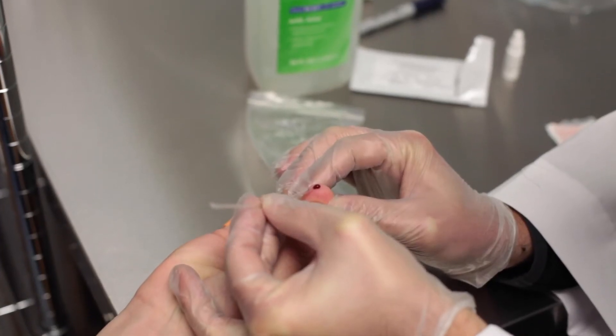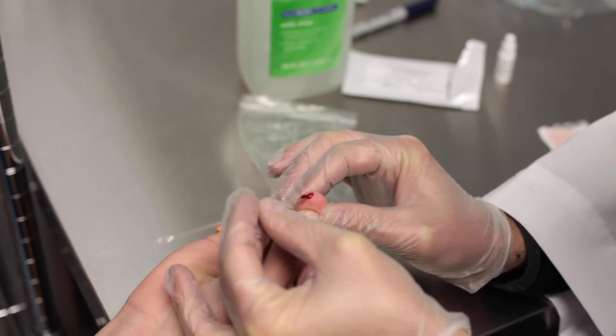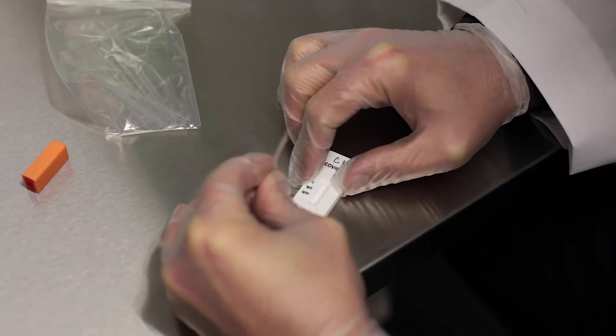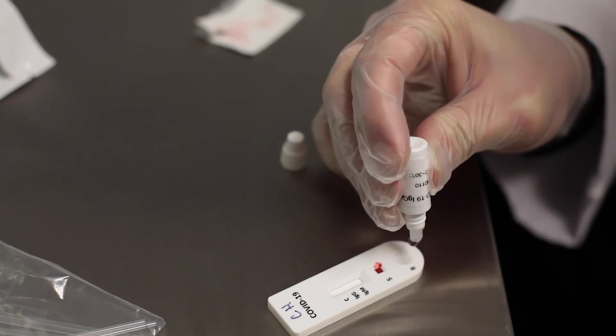Use the disposable capillary to draw the blood. Be sure to fill it completely to the fill line. Then transfer your finger stick blood specimen to the well marked S. Add two drops to the circular well below marked B.